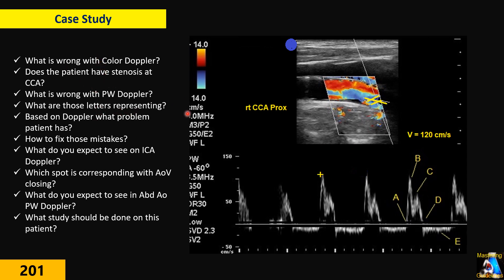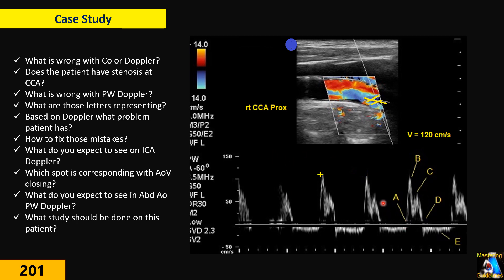What is wrong with the pulse Doppler? What do those letters A, B, C, D represent, and exactly what are they representing? Based on these two findings, what problem does the patient have — what is the diagnosis, just based on this duplex study?